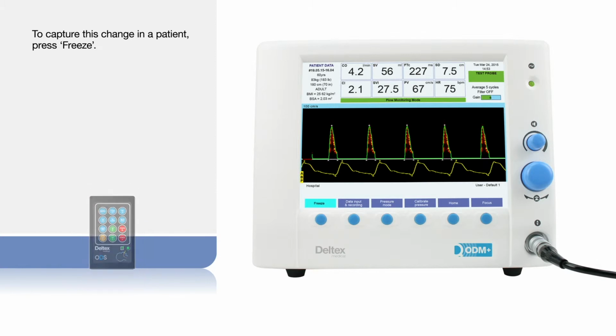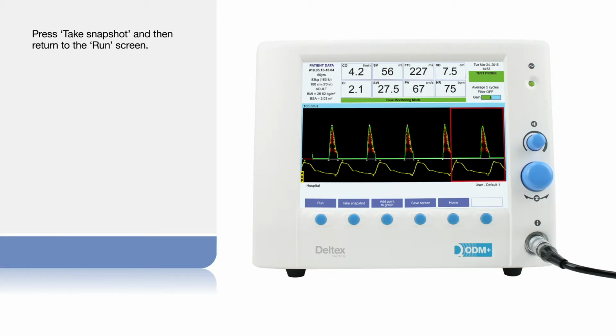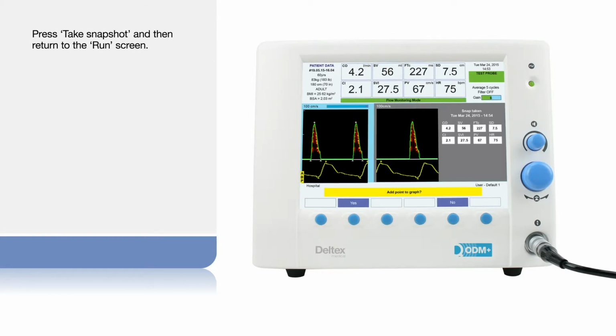To capture this change in a patient, press Freeze and centre the red window over the waveform. Press Take Snapshot and then return to the Run screen.